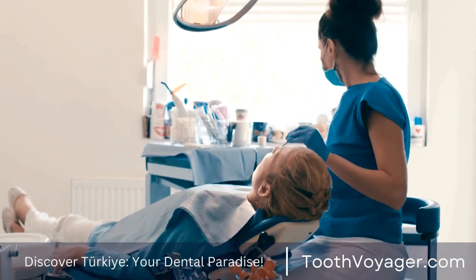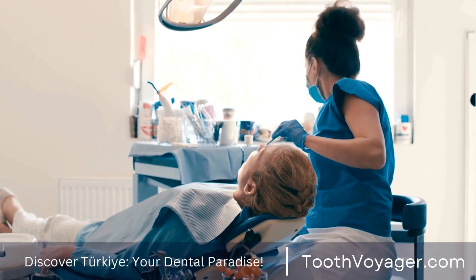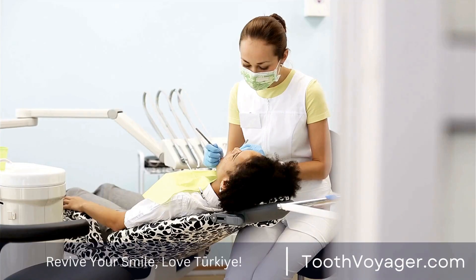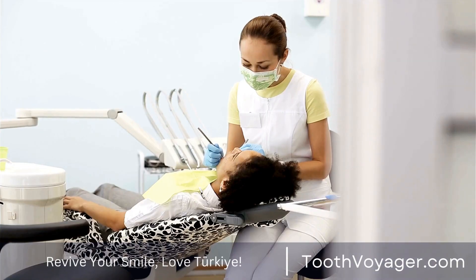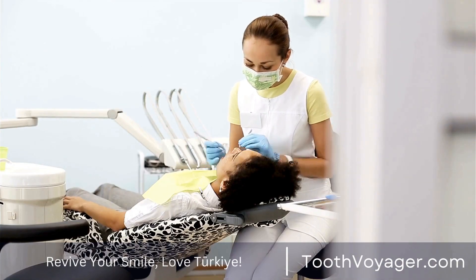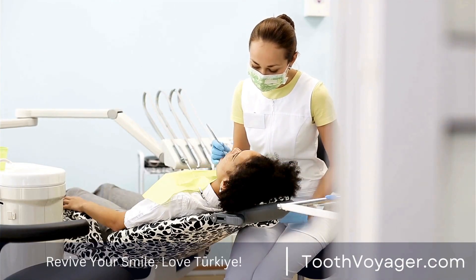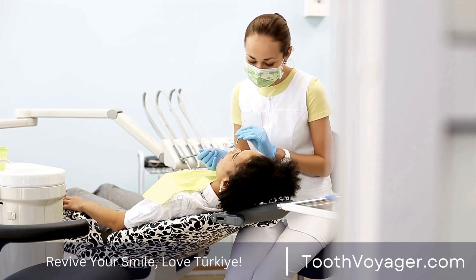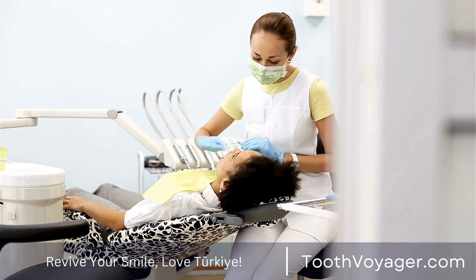Maryland bridges can be a more conservative option. They involve the false tooth or teeth connected to metallic or porcelain wings, which are fixed to the back of the natural teeth on both sides of the gap.